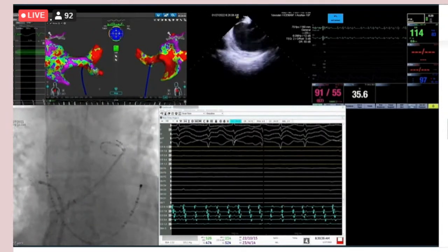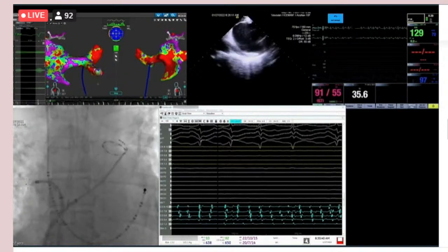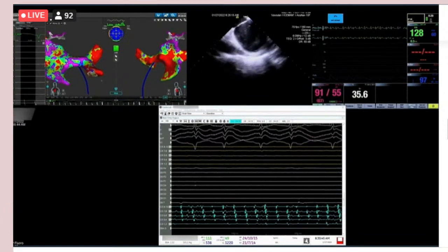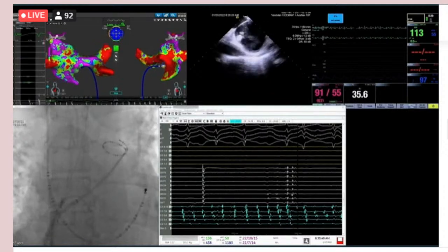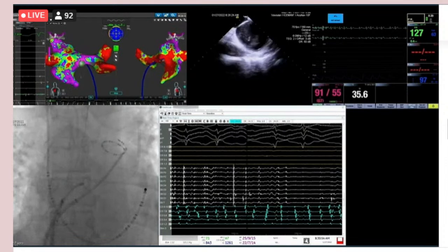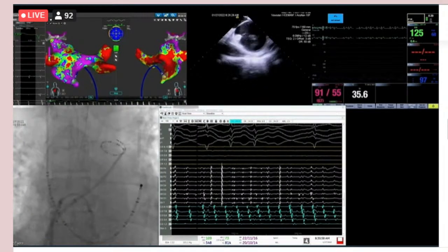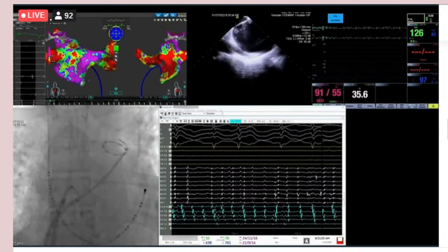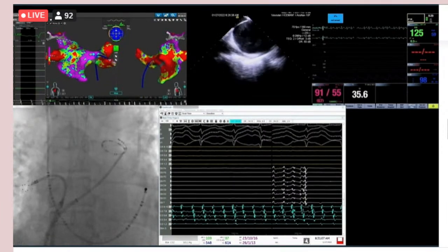This patient was persistent, and by the way, this was not a case involved in the trial. This was off the IDE, outside of that. But as part of this, they're supposed to be persistent in the trial that's being performed. And this patient had already failed cardioversion, antiarrhythmic drugs, et cetera, and I think had been persistent for at least 6 months by the time they had made it to the lab.